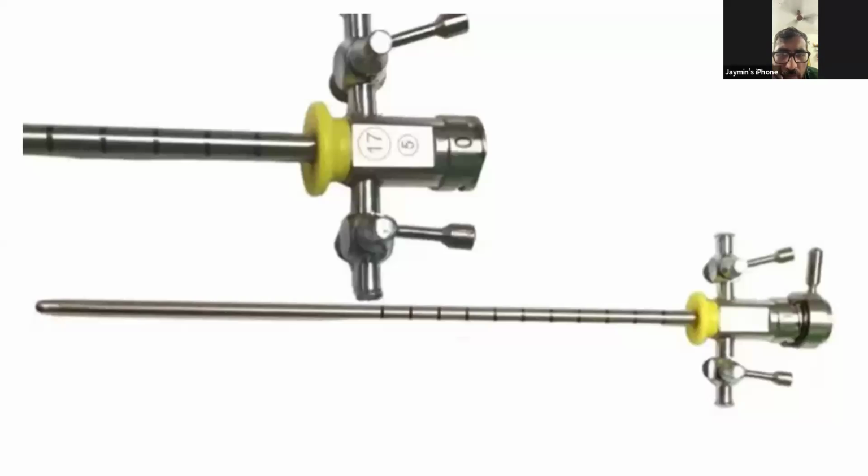It is a 17 French cystoscopy sheath, sir, with markings over the sheath visualized at 1 centimeter interval from 10 centimeter from the vesical end, with outlet and inlet for the fluid, and number 5 indicates the maximum ureteral catheter size which can be passed through this sheath.